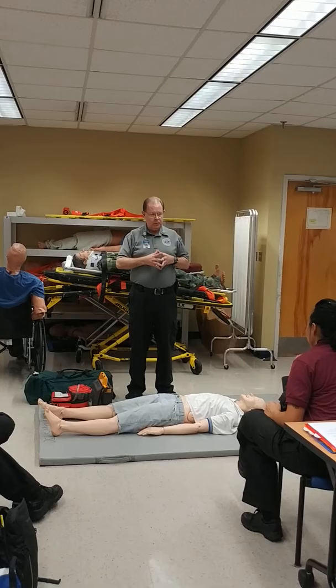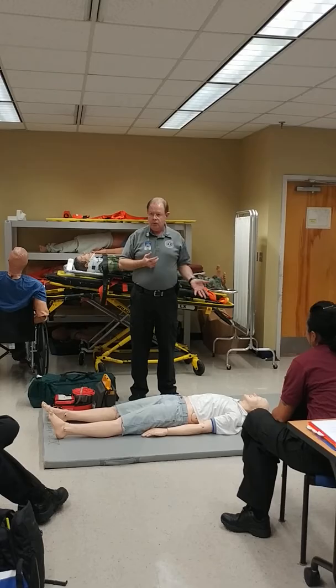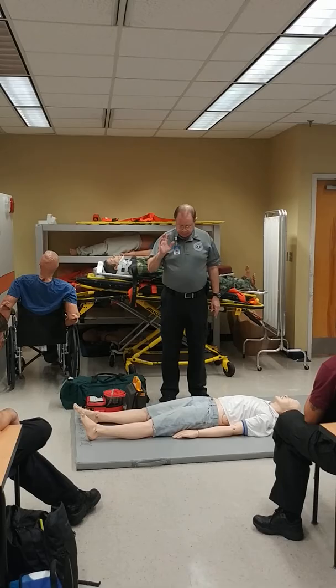What will often happen is people will get distracted — especially when putting the patient on the board and strapping them down. Next thing you know, everybody's strapping and nobody's doing compressions or ventilations. When you do the roll, take the bag off — you're not going to be bagging while rolling. Thirty seconds delay for ventilation is acceptable, but only ten seconds for compressions.